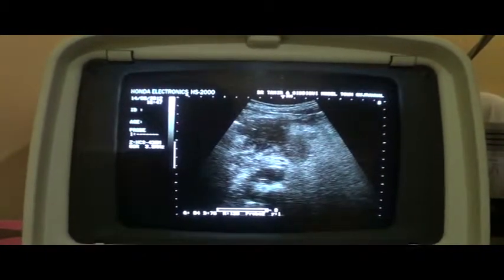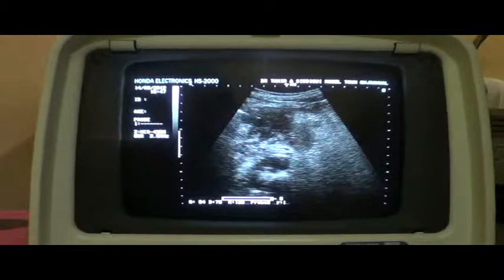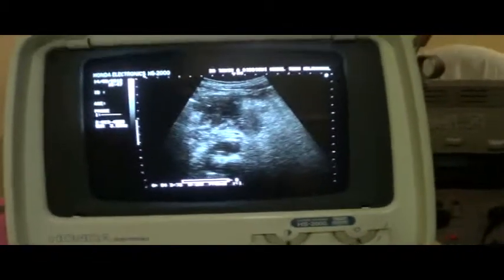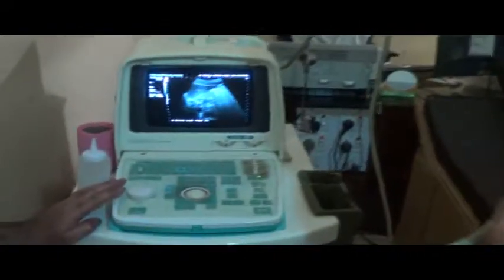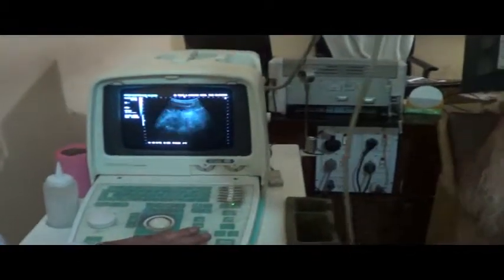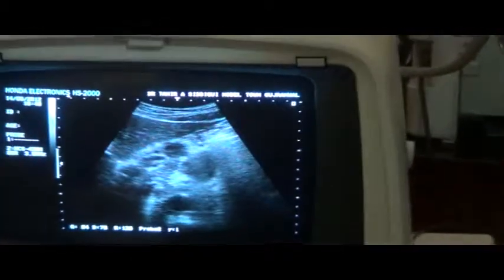I am going to ask the patient to stand up and scan, because the organs will come downwards and the pancreas will come downwards, and I will scan in standing posture. I am going to scan the pancreas in standing posture. There is some pancreas visible. I am going to try to see the pancreas - see if there is any difference compared to what we saw when the patient was in supine posture versus what we are seeing now in standing posture.